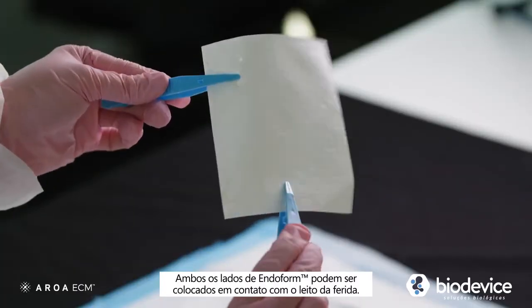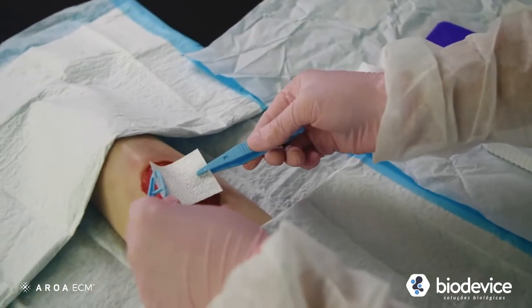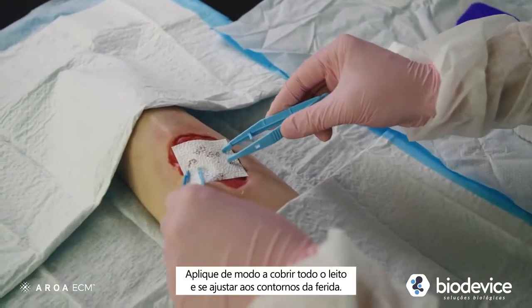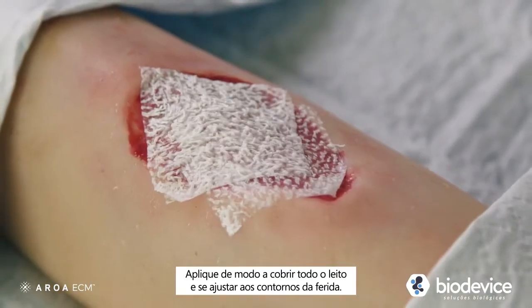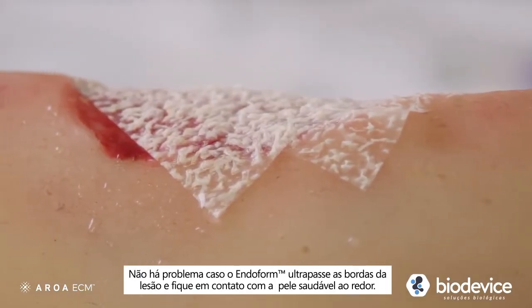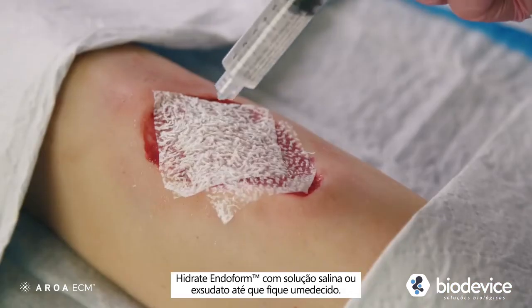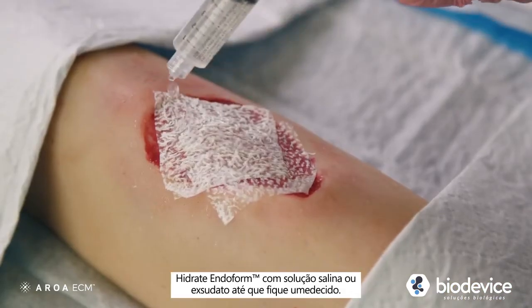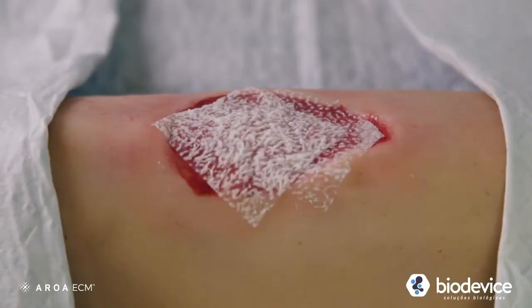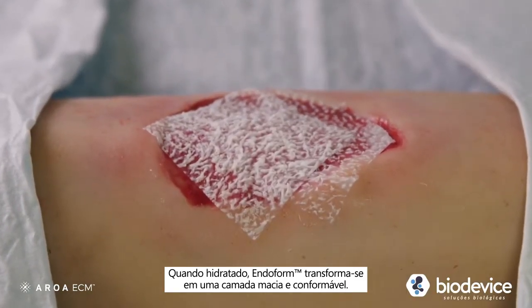Either side of Endoform can be placed down on the wound bed. Apply so that it covers the entire wound bed and conforms to the contours of the wound. It's okay if Endoform overlaps onto surrounding healthy skin. Rehydrate the Endoform with saline or exudate until moistened. When rehydrated, Endoform transforms into a soft conforming sheet.